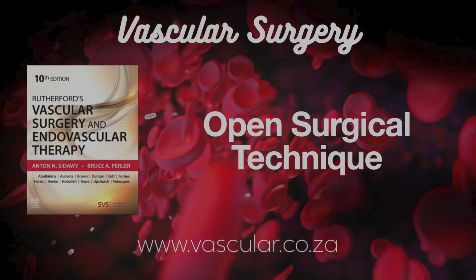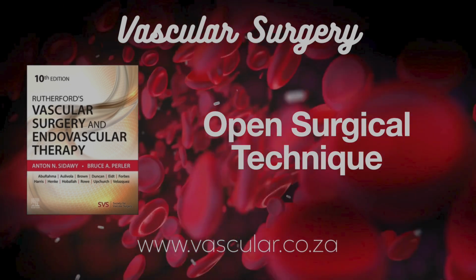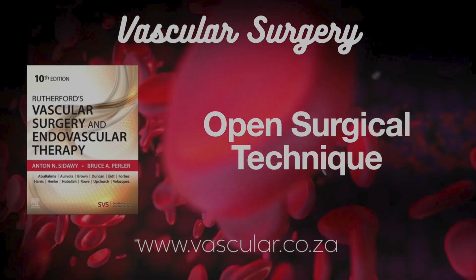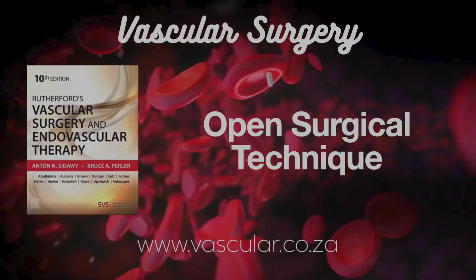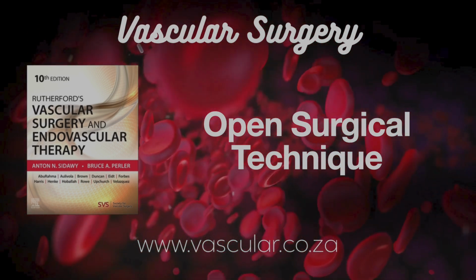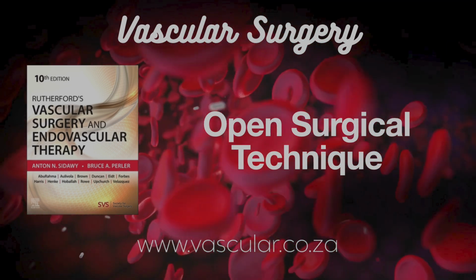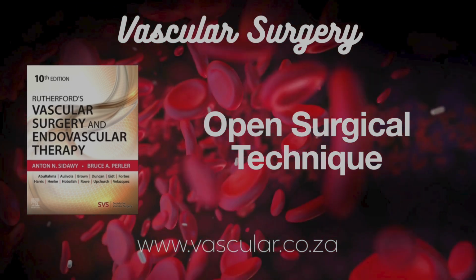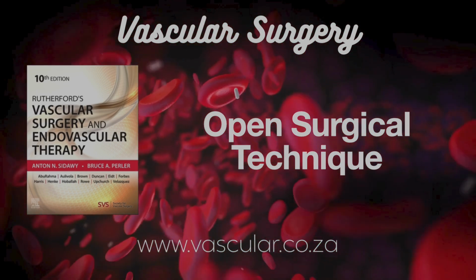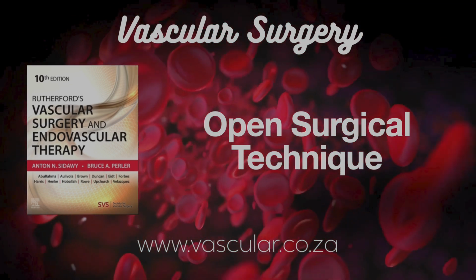Okay, let's start with that first step, getting to the vessels, exposure and dissection. What are the key principles there? The main idea is finding the most direct, efficient route to the target vessel. How do surgeons decide where to cut? They use anatomical landmarks, the feel of the tissues, where the pulse is. For instance, doing a leg bypass, you need the inflow pulse palpable right there in the surgical field. Makes sense. Vessels are usually found between muscle bellies. If you find you need to cut through a lot of muscle, you might rethink the approach. Gentle handling important. Crucial. Gentle handling of skin and soft tissues helps prevent wound healing problems. Also, tiny lymphatic vessels need careful handling, ligation and division to prevent fluid buildup, avoiding cautery near lymph nodes.